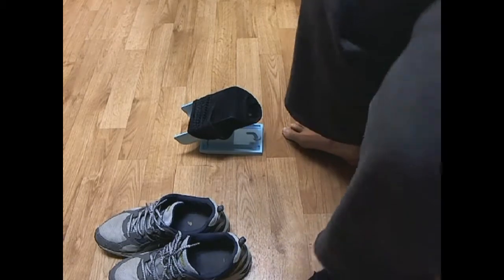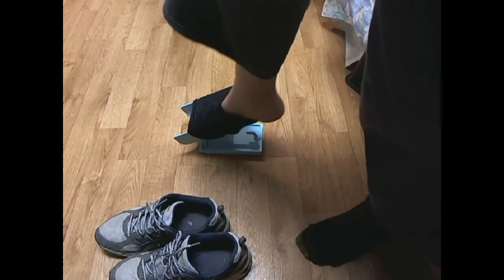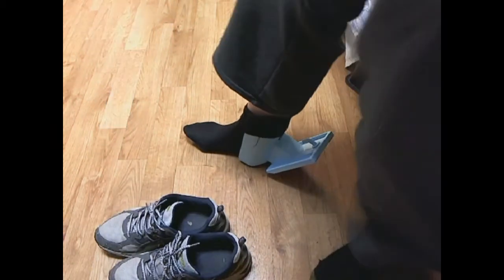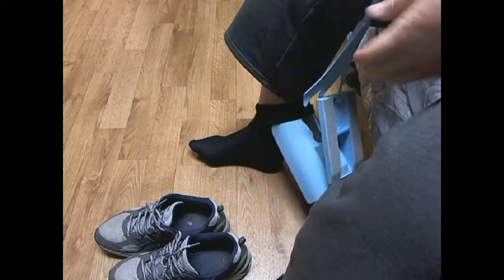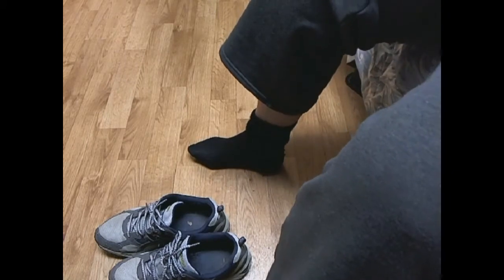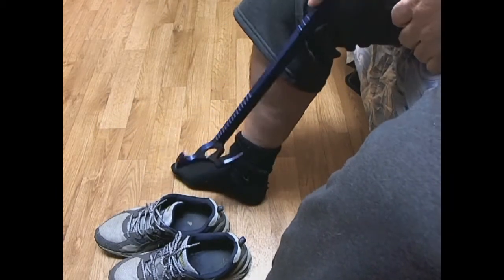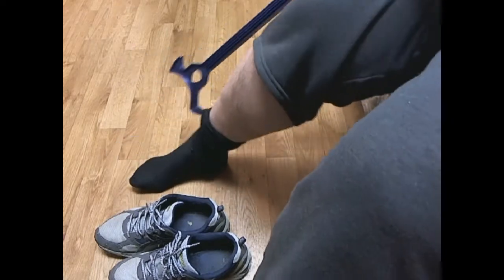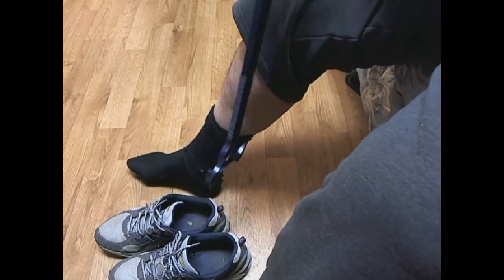So basically, you stand up, put your foot in it, you push down and around, and you're up. Then you can take this thing, so you don't have to bend over, and you pull it up. Then, of course, it's not quite on, so I take my grabbers and I'll basically pull it up with that, which is why this is a really useful device. Helps you pull it up. I get exceptionally annoyed when my sock is not real high, but that's how that one works.